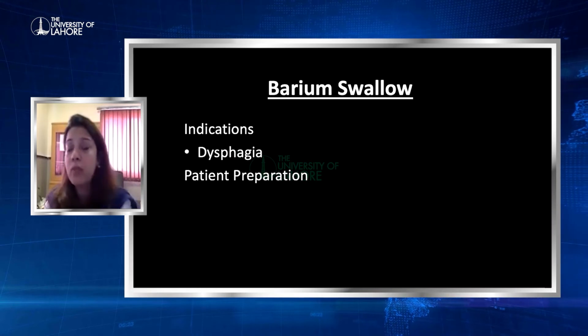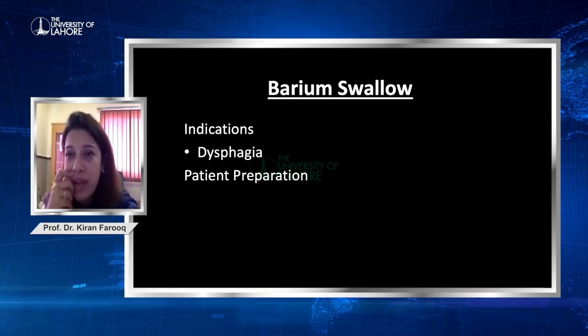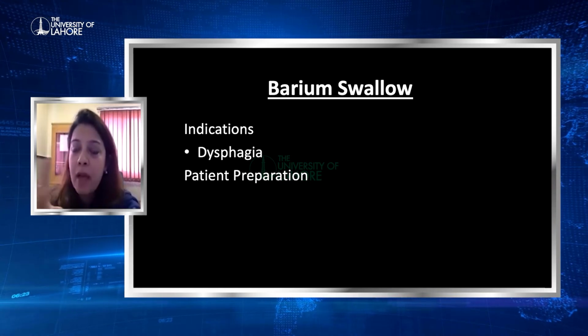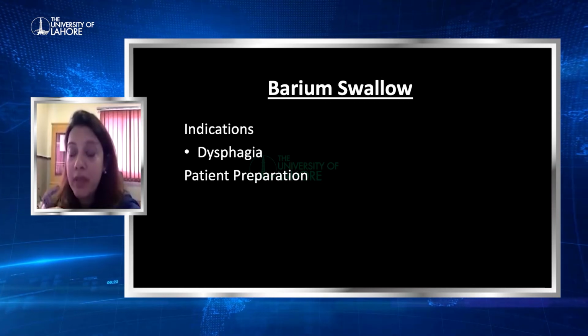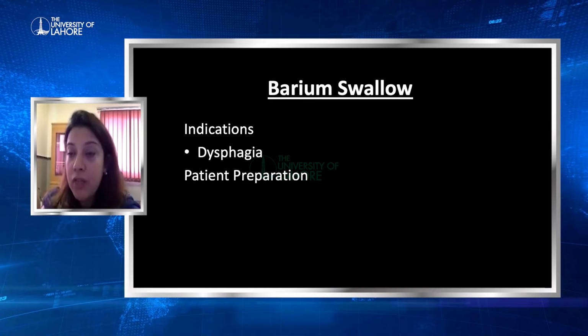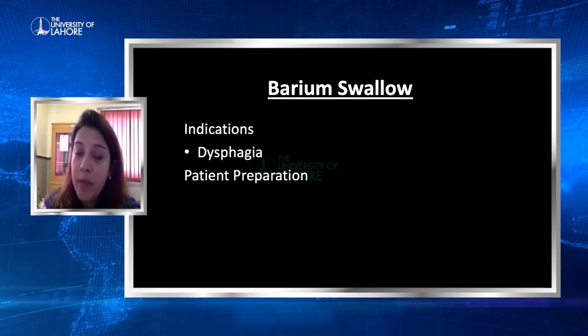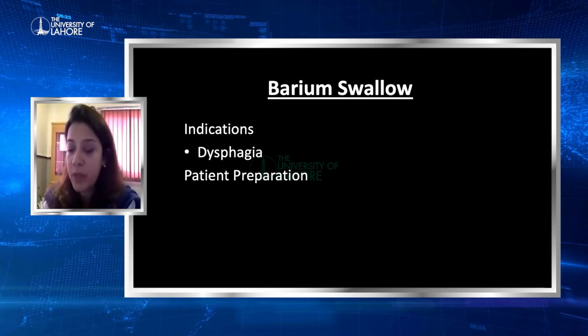So coming to the barium swallow, I think barium swallow is the only test we are doing right now, because most of the other tests, the barium enema and the barium meal, have been replaced by endoscopies, right? So the barium swallow, the main indication is dysphagia to solids or liquids. No patient preparation is needed. You can do it as the patient comes.